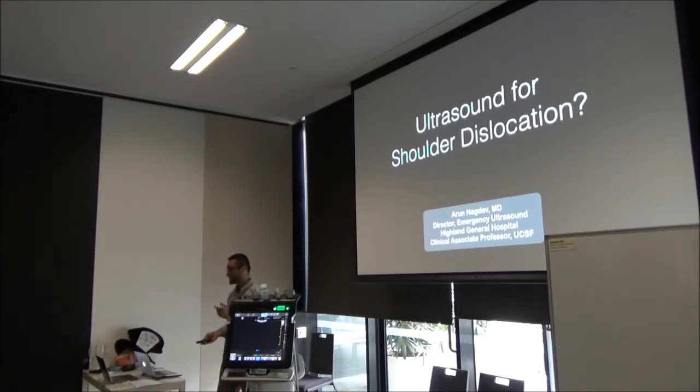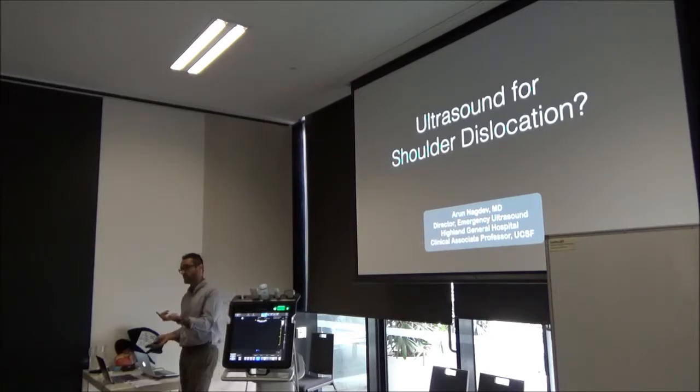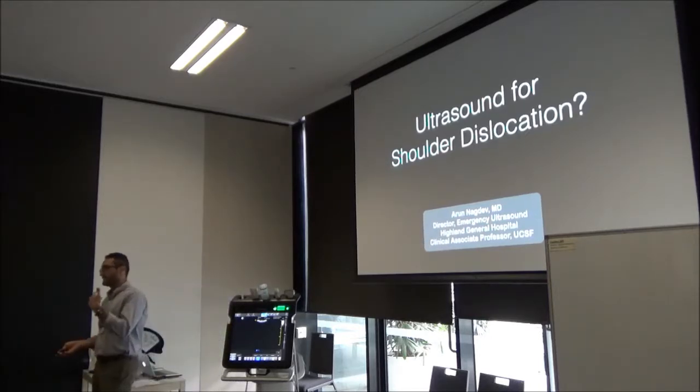It's also nice for when I reduce somebody's shoulder and the x-ray is coming in, especially if I've used procedural sedation, and I don't want them to wake up and find out it's not in. So I just have them lay up, and I'll show you how to do this. I look, confirm it's in, then they can get the x-ray and I can move on. It makes it really easy.